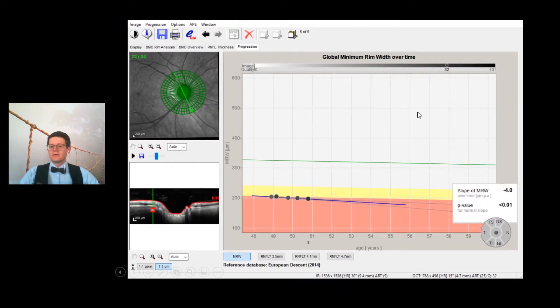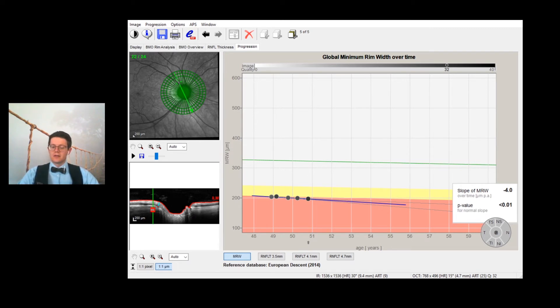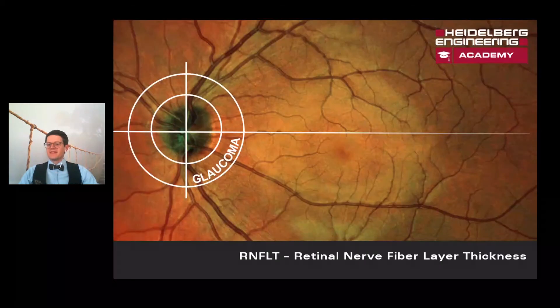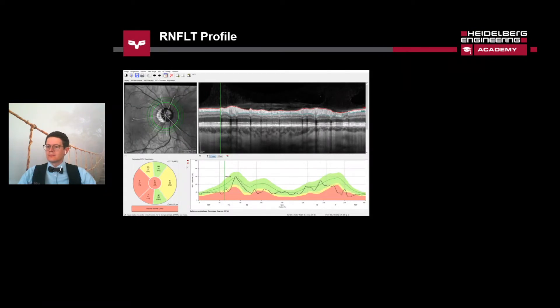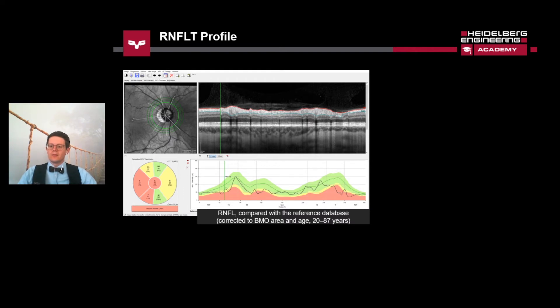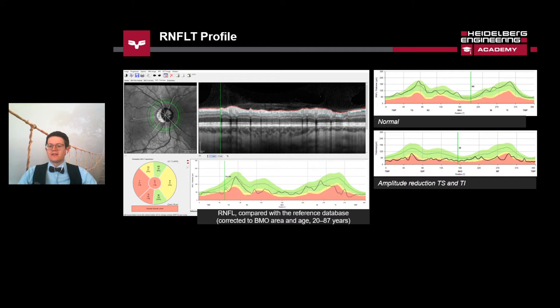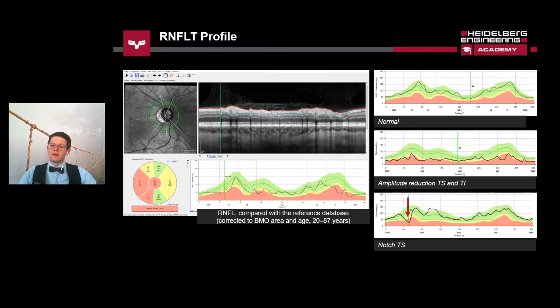If you have five or more measurements you get a solid line showing the comparison of each measured examination's values, along with a slope in microns and a p-value indicating the significance of the progression. The second important parameter is RNFL thickness, also obtained from the ONHRC scan. The analysis of the RNFL profile is similar to the BMO-MRW. The greatest difference is that we have two prominent humps in the RNFL measurement, which may be flattened if there are amplitude reductions or notches, as seen in focal defects.